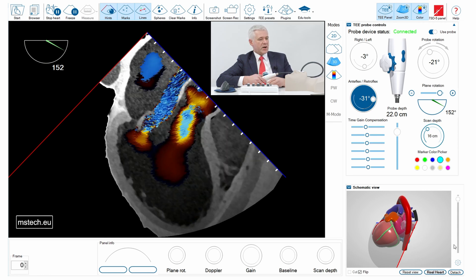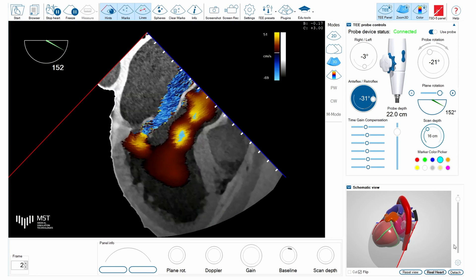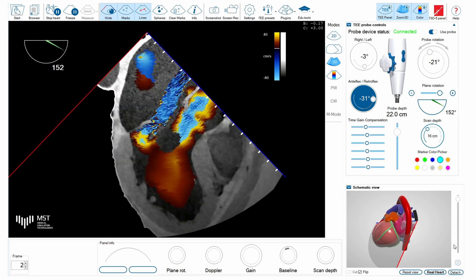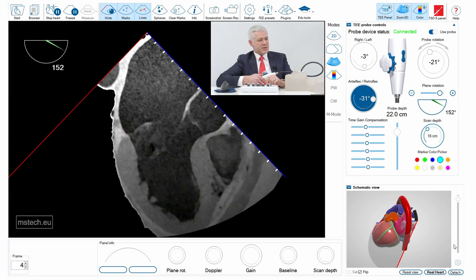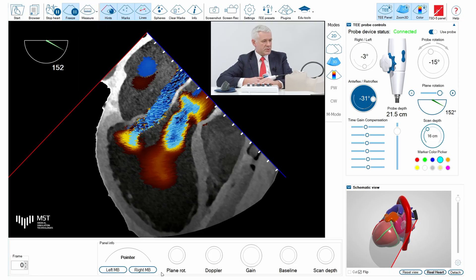I activate color mode and change the baseline to approximately 40 centimeters per second Nyquist limit. You can then see a nice PISA. I stop the image, select the frame, and measure the PISA diameter using the measurement function — placing one marker here and the other on the PISA. It measures approximately one centimeter in PISA diameter.